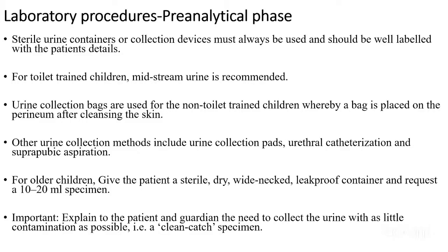Now, this is where the lab comes in. And so we are going to keenly look at the pre-analytical phase, because in the lab, we say it's garbage in, garbage out. Whatever we receive is whatever we process and give results. So we have to be very careful with the pre-analytical phase. It is the most important phase in the lab, and we have to be very keen.